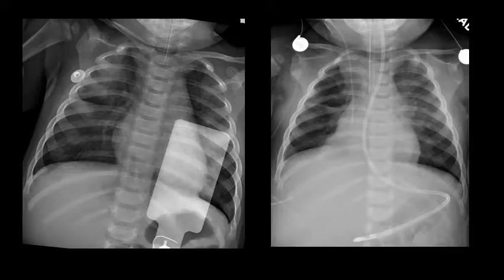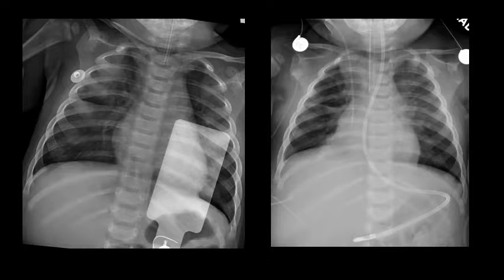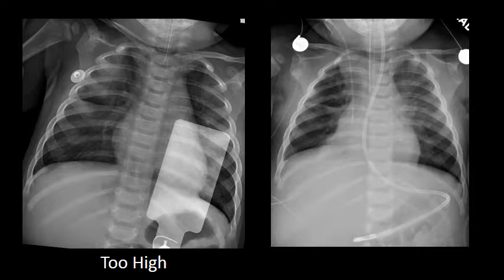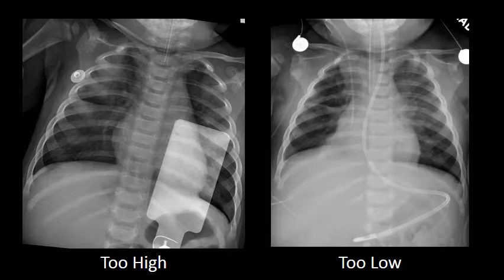Here are two examples of pediatric patients. Take a look at these two cases and decide whether you think the endotracheal tubes are in appropriate position. I would argue that the first image shows a catheter tip near the thoracic inlet, which is too high. And the second image shows the catheter tip at the carina, which is too low.